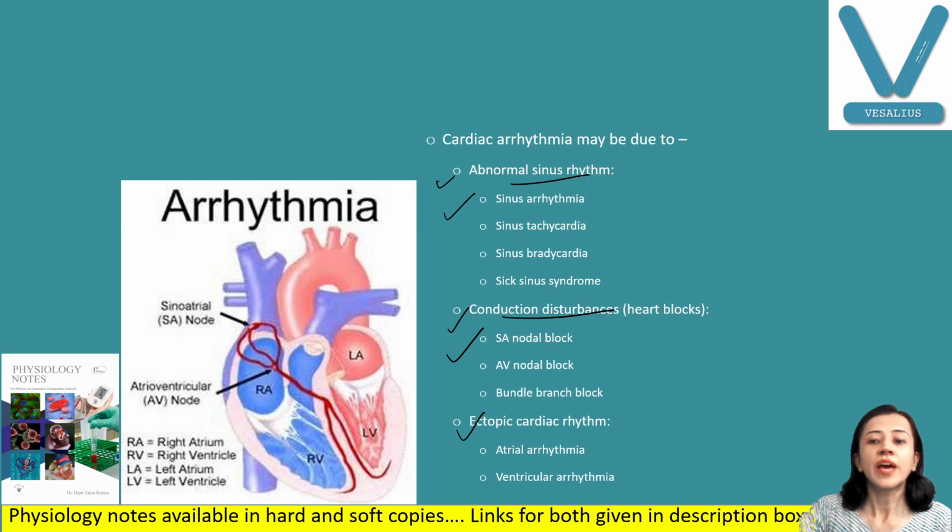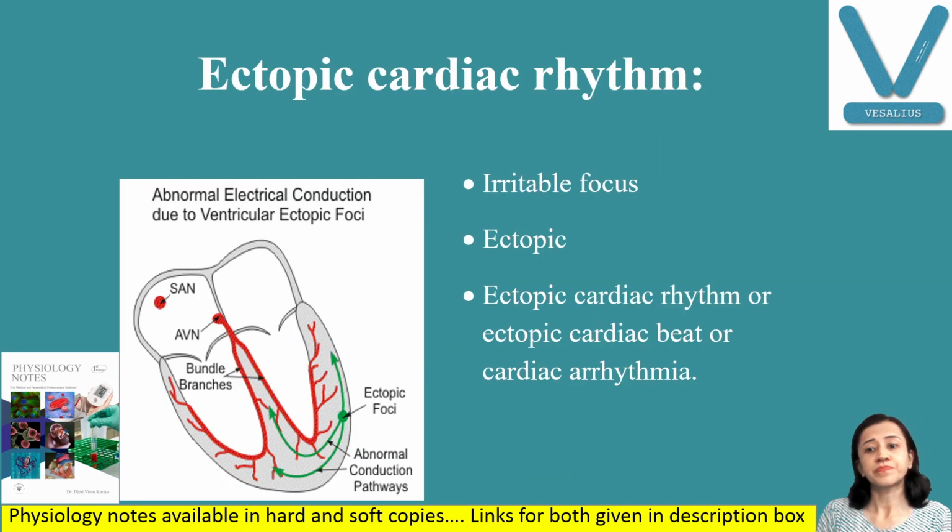Now, ectopic cardiac rhythm. Ectopic means the focus is not natural. Any irritable focus that is capable of discharging repetitive impulses rapidly as compared to the SA node.